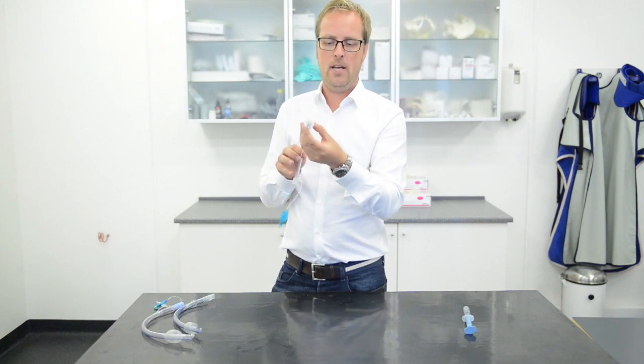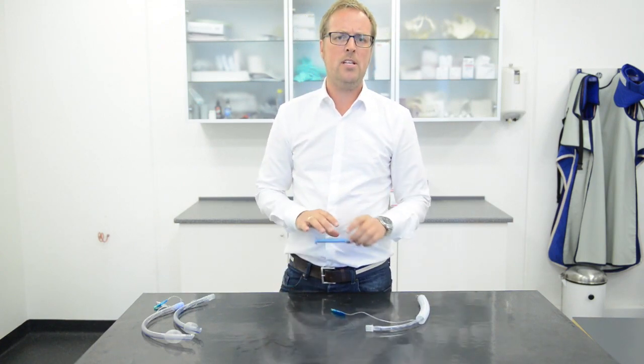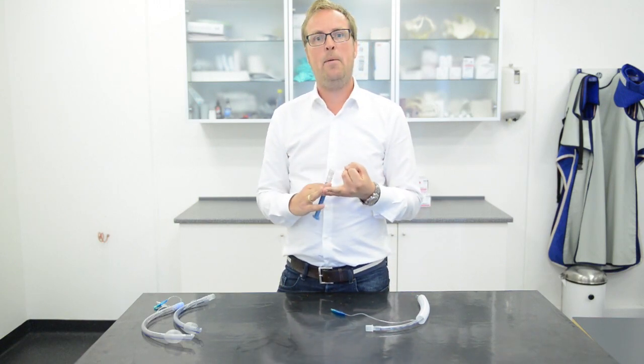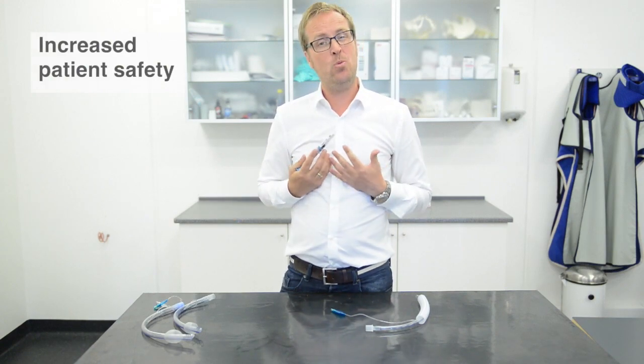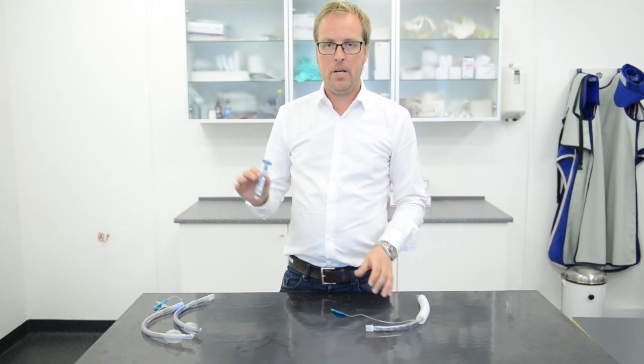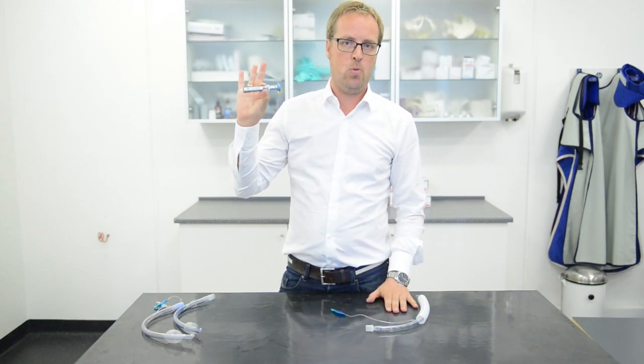As long as you're between 20 and 30, you're fine, and you can see it has a good fit in the trachea here. By using this device you will get less complications, happier patients, fewer returns, and peace of mind — and happy pet parents. So please, the AT Cuff Fill — it's worth it.